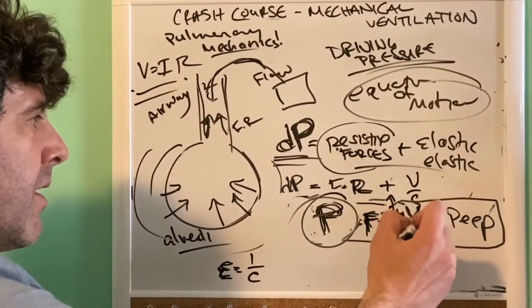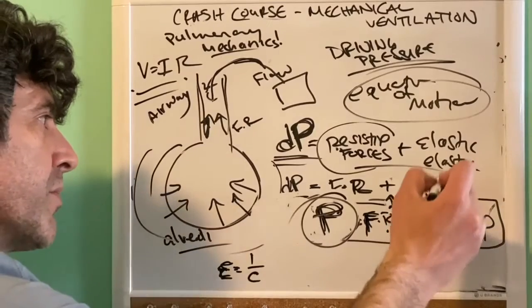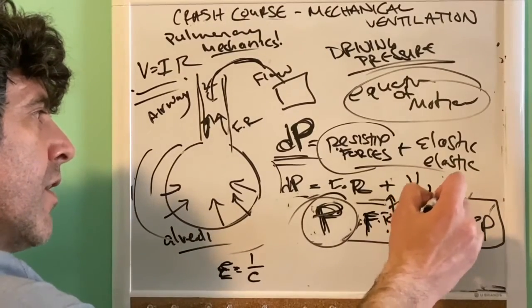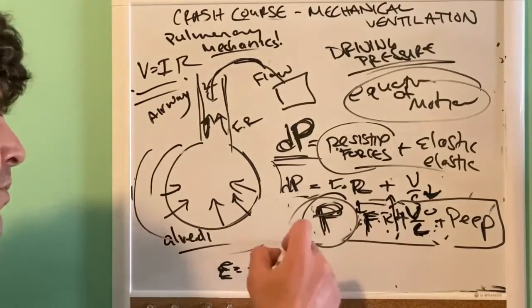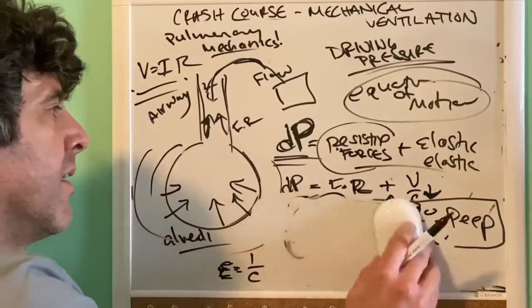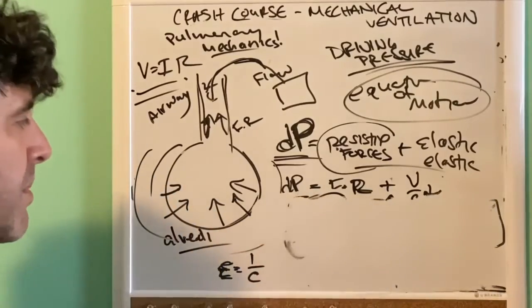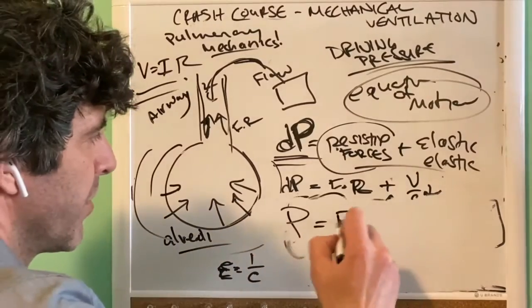But will your volumes go down? Yeah, your volumes will go down, and your flow will probably decrease to equal this. And so everything can really be explained by this equation, and we'll make it simpler in a second.